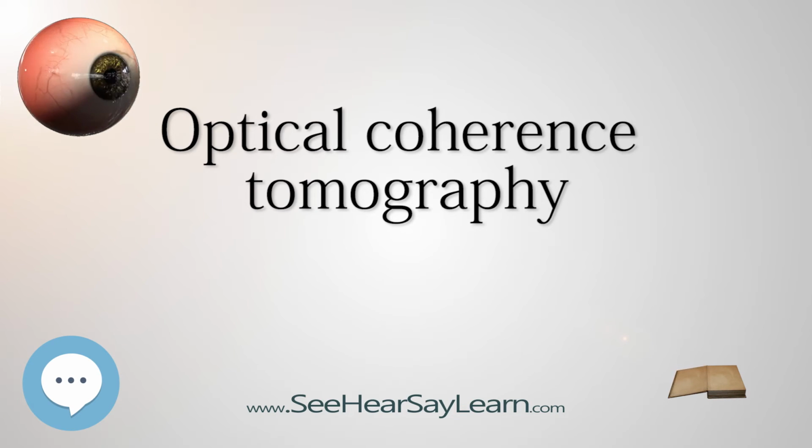Layperson's explanation. Optical coherence tomography, or OCT, is a technique for obtaining subsurface images of translucent or opaque materials at a resolution equivalent to a low-power microscope. It is effectively optical ultrasound, imaging reflections from within tissue to provide cross-sectional images. OCT has attracted interest among the medical community because it provides tissue morphology imagery at much higher resolution, better than 10 µm, than other imaging modalities such as MRI or ultrasound.